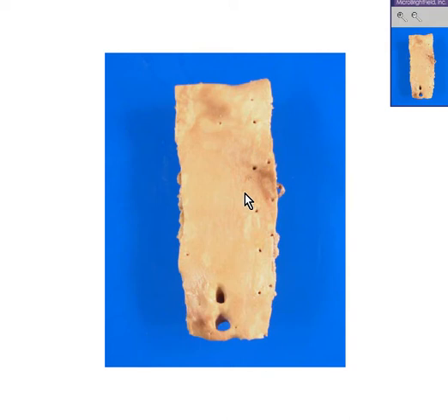These are called fatty streaks, and they are the very earliest gross evidence for atherosclerosis, usually seen in teenagers or even children.